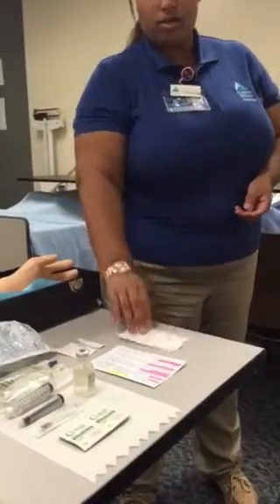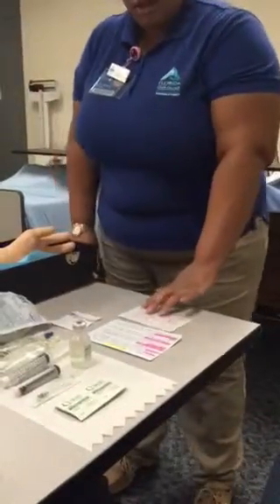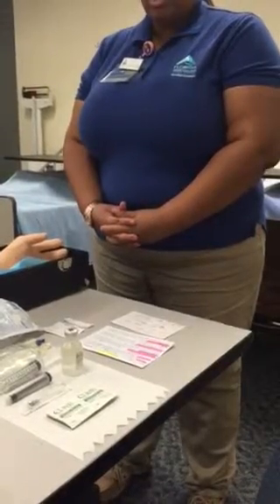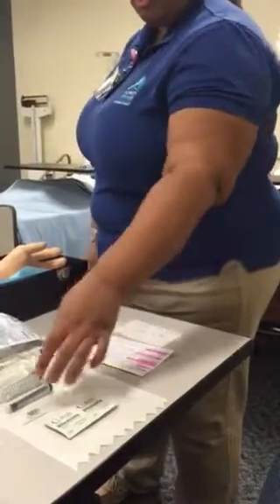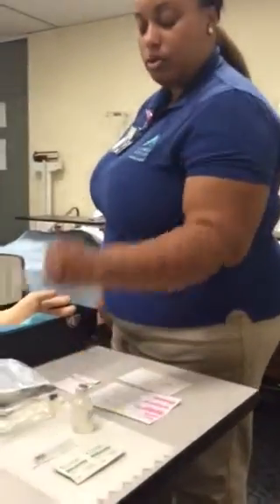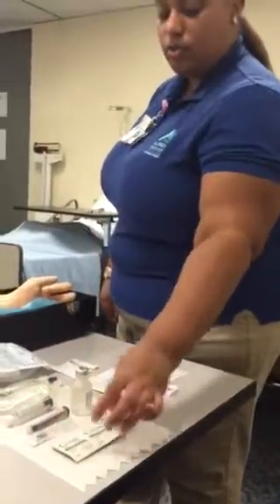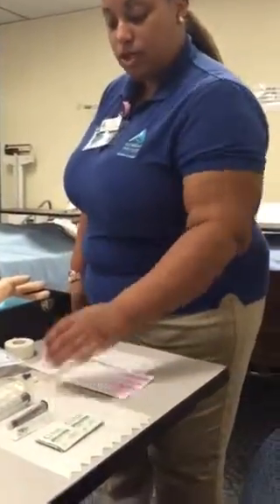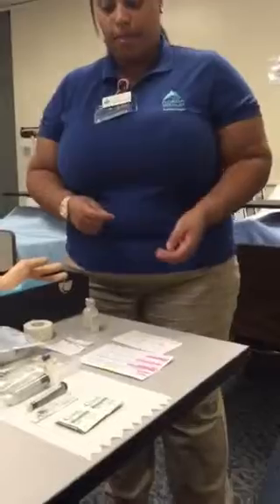I also want to make sure before I go in my patient's room that I verify the labs and the allergies of the patient. Before I go in my patient's room, I need to collect my supplies. My supplies will include my IV tubing, my bag, my normal saline syringe, which is pre-filled, my syringe for drawing up my drug, my needle for drawing my drug, some alcohol preps, and some tape. The first thing I'll need to do is wash my hands and put on some gloves before I prepare my medications.